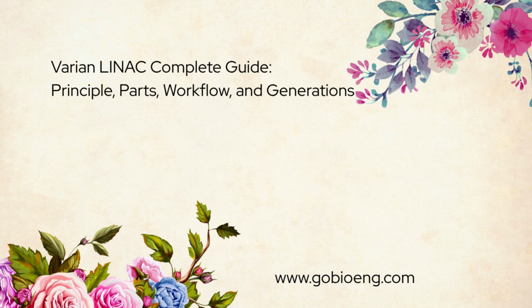For clinicians and medical physicists, the LINAC is the final delivery point of the treatment plan. Clinicians focus on the tumor target, organs at risk, fractionation, treatment intent, and patient outcome. Medical physicists focus on beam quality, dose measurement, output constancy, imaging accuracy, mechanical precision, commissioning data, quality assurance, and safety interlocks. For engineers, the LINAC is a safety-critical electromechanical and software-controlled system.